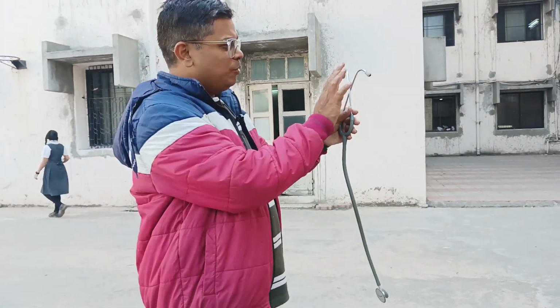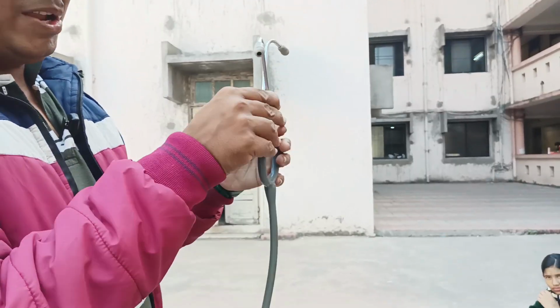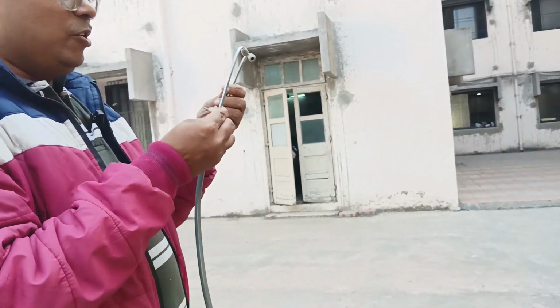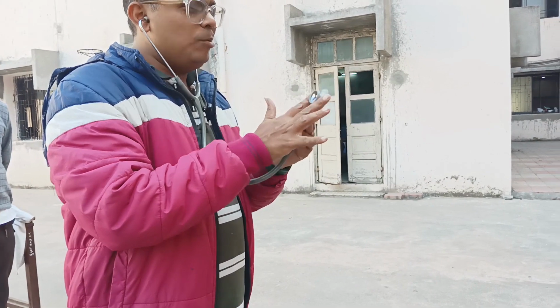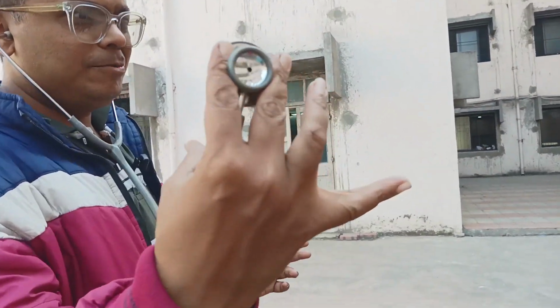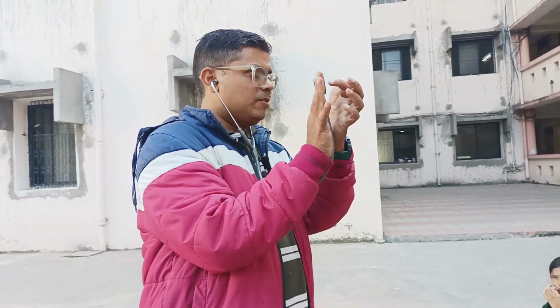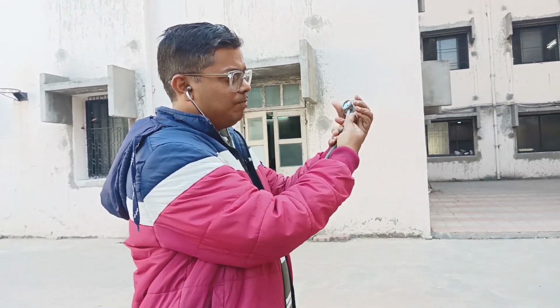Stethoscope, in that you have to put this side like that. Okay, this side is towards you like that. And then you have to put this thing in your ears. Okay, and the down part you have to hold like that and just knock it here. If sound comes, then it is okay. If sound does not come, then just turn it around.